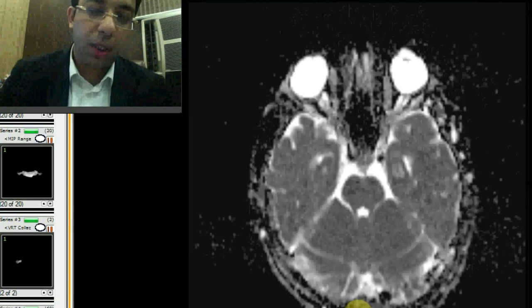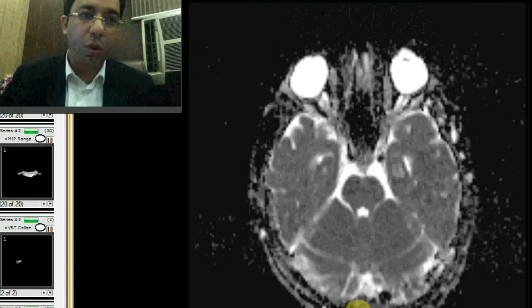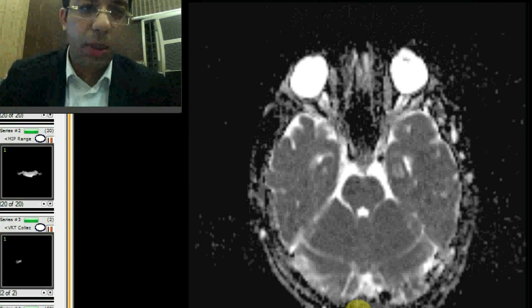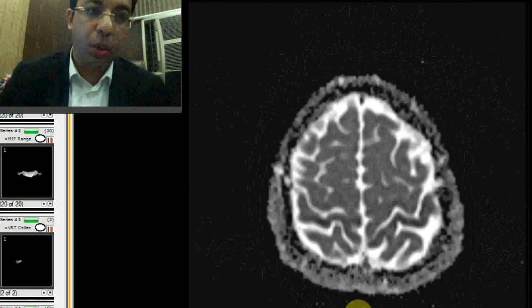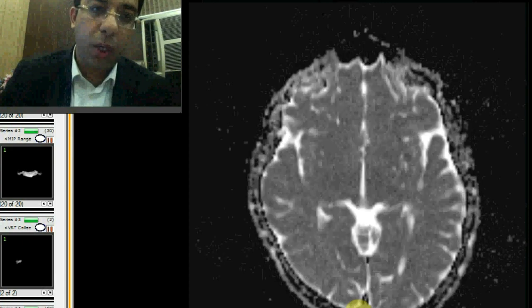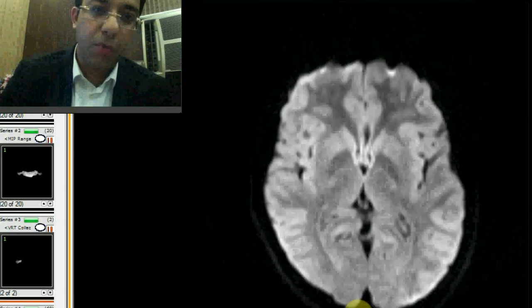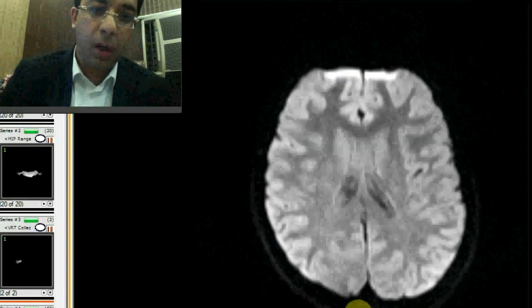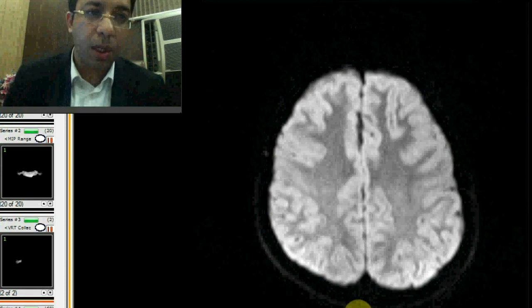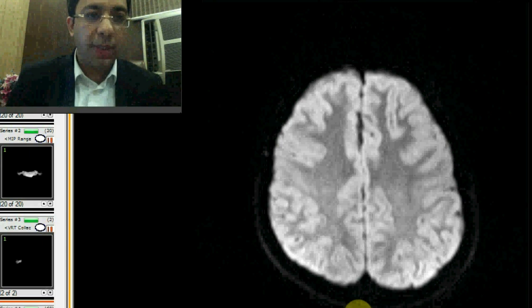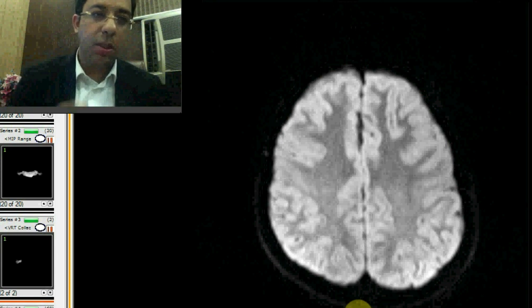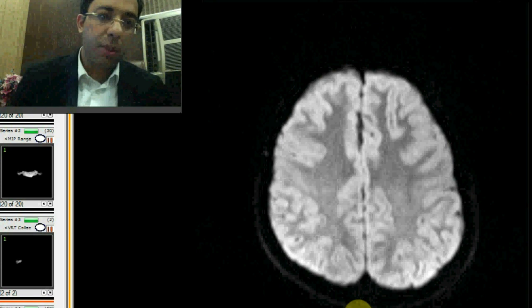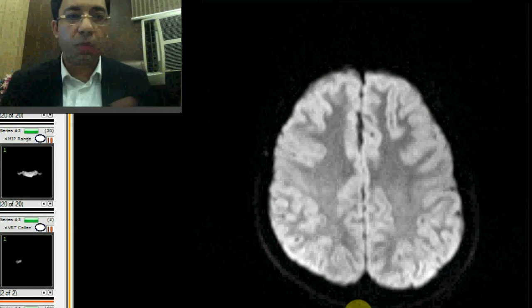In a routine MRI brain, we also do diffusion imaging, which has two parts: a Diffusion Weighted Image (DWI) and an Apparent Diffusion Coefficient (ADC) map. On the ADC map, an infarcted area would appear dark. On the DWI image, an infarct appears bright because it is an area of diffusion restriction, and the corresponding area on the ADC map would look dark. So a routine MRI brain includes transverse, sagittal, and coronal images, plus diffusion, FLAIR, T1, T2, and gradient echo sequences.